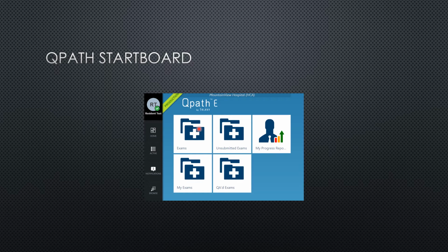And the way this works is, so this is all exams, including anything that's claimed or unclaimed or anything. These are exams that you have claimed by either putting your 3-4 on the scan or by doing QView and claiming it. These are the exams that you have, so then it gets subdivided further, I should say. So these are the exams that you've claimed that you had not submitted for QA. And that's important because when you submit for QA, that's when you're saying, this is complete, it's ready for you to take a look at Dr. Dave's and to say whether or not it's adequate, right?